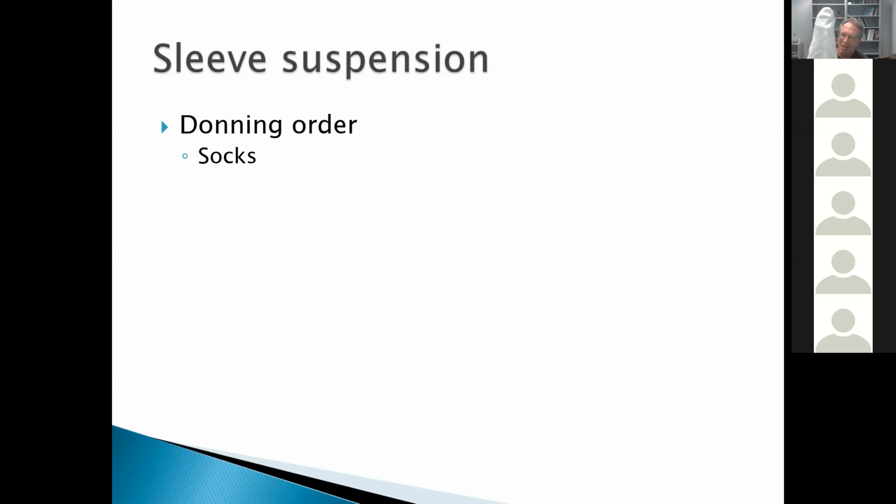Because the technology of skiing and ice skating has improved, the socks are probably very warm, but not quite this thick. But when I was young, the winter socks could be really thick like this. This is probably a 6-ply, it's called. The main reason for this is the thickness itself, because it helps take up space in the socket, because the space that you need is going to vary depending upon several things, probably the time of day and its changes in edema.